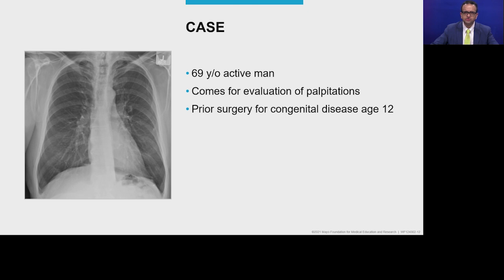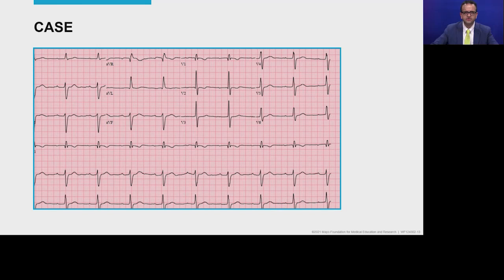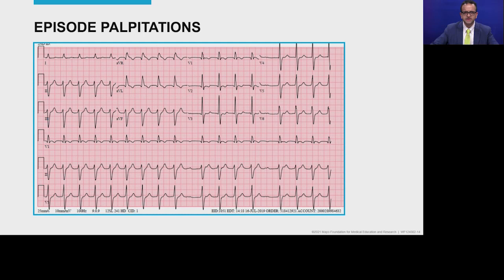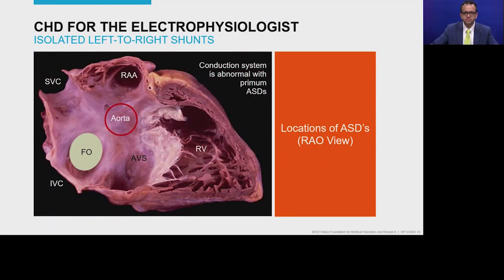Another case: a 69-year-old man who comes in for evaluation of palpitations. He tells you he had surgery when he was about 12 years of age. The ECG shows sinus rhythm with a right bundle branch delay pattern, but now with left axis deviation — different from the right axis deviation seen earlier. When the patient has palpitations, an ECG shows atrial fibrillation. Whenever there is right bundle delay with left axis deviation and arrhythmias, another ASD comes into picture — ostium primum ASD.